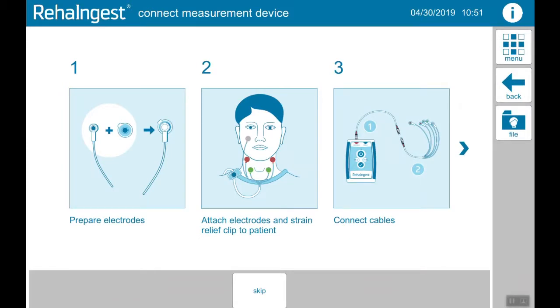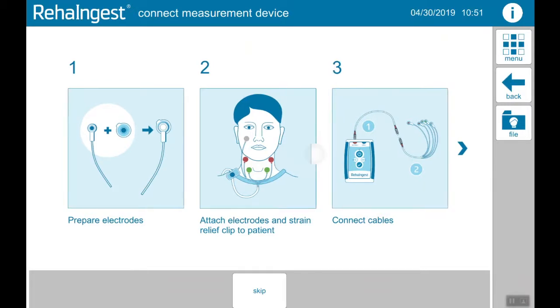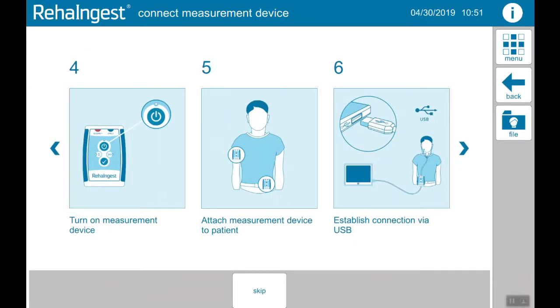Now you need to do six steps: first, preparing electrodes; second, attaching electrodes on the patient; third, connecting cables; fourth, turning on the measurement device; fifth, attach the device on the patient if needed; and sixth, connecting USB cables. After doing these six steps, tap on the screen.